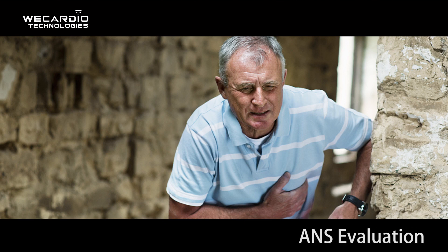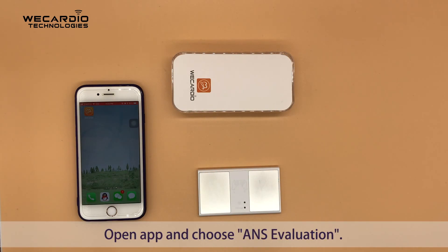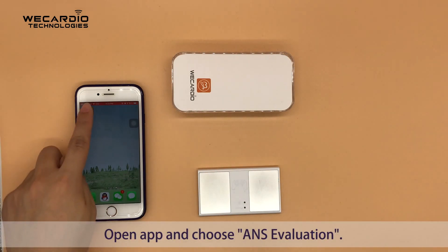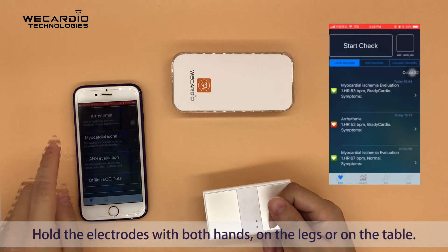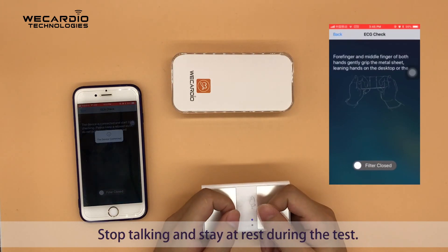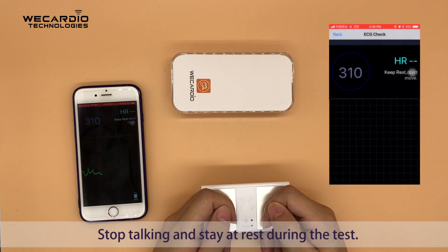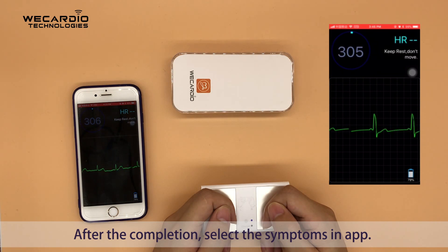ANS Evaluation: Open the app and choose ANS Evaluation. Hold the electrodes with both hands, resting on the legs or on the table. The test takes five minutes. Stop talking and stay at rest during the test. After completion, select the symptoms in the app.